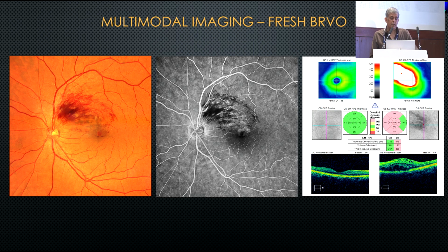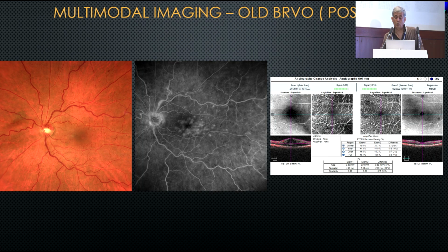Here's a patient of a BRVO, where for the workflow, the method of monitoring, we've used just the OCT and the angiography, and you can see the amount of fluid that has accumulated there. This is an old patient of BRVO. I mean, she's had BRVO for a long time. We've given her multiple injections, and the follow-up is usually done for her by OCT alone, which is showing an improvement in the slide on the right.